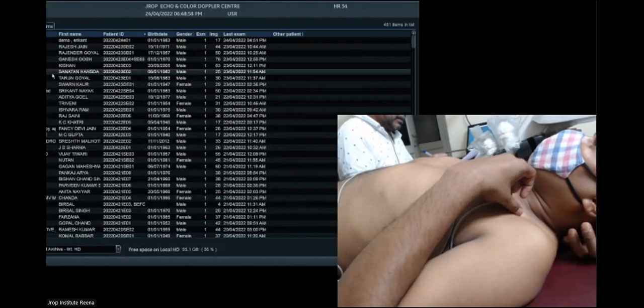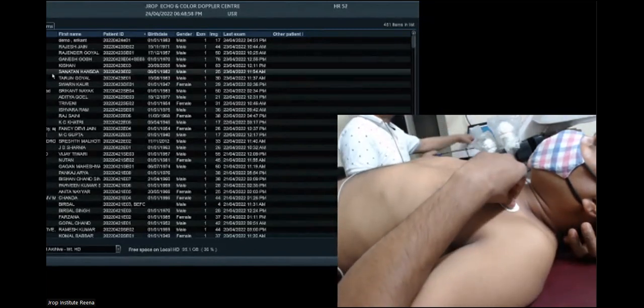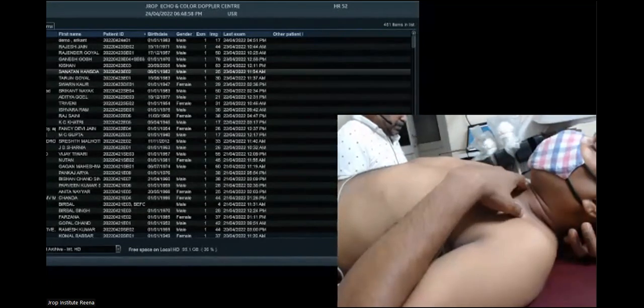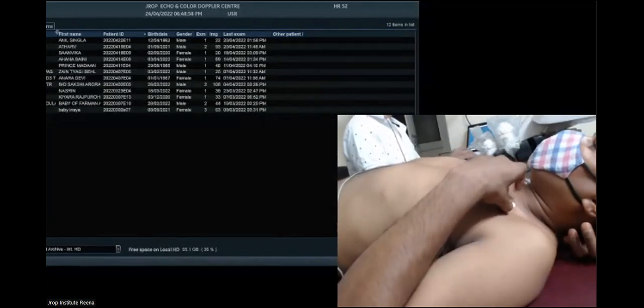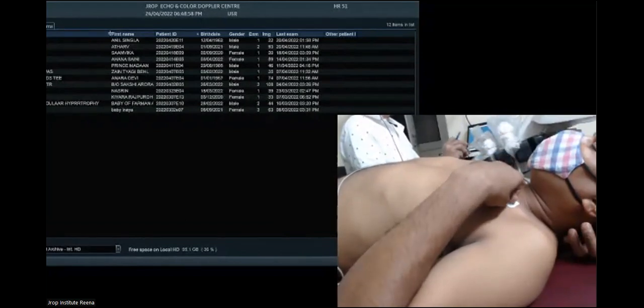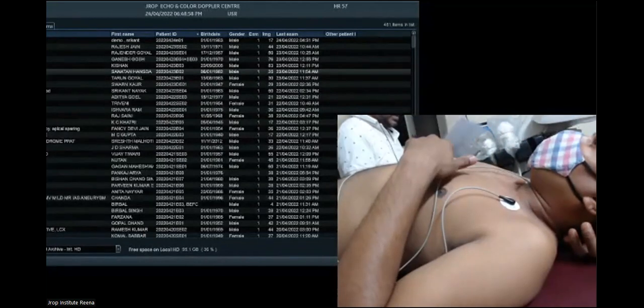Sir, is there any importance of this measurement of MAPS? We have been talking MAPS. This is old times requirements. You know, now we don't measure MAPS. So do we really need to measure such things? Because in usual echo reports, we don't see such things, MAPS or something. Some people have been utilizing it for a long time, so we can't say no to them. So should we consider it? I don't use it. You don't use it? Yeah. Okay, sir. Thank you, sir.